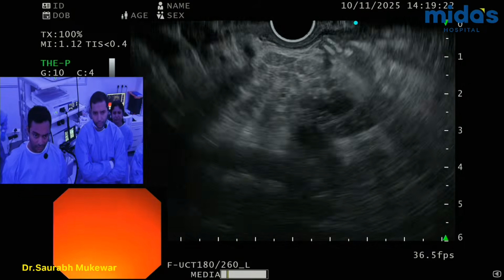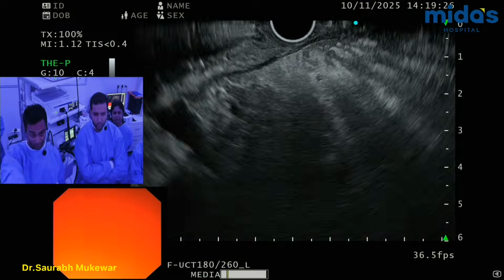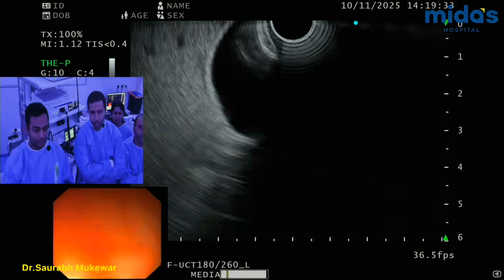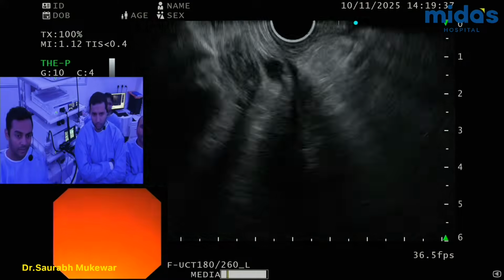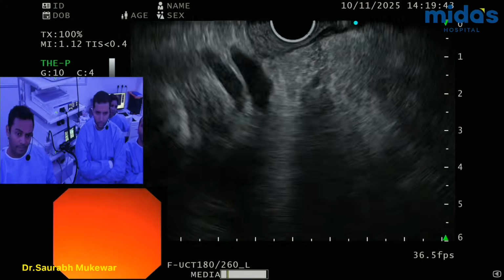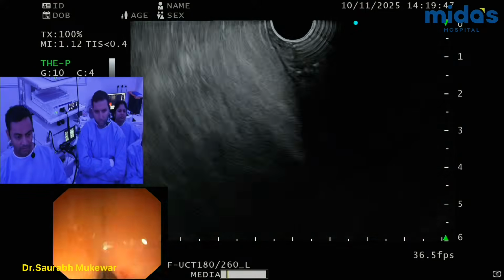Now, here's a challenge. Now, I can't really go here because it's the head and the lesion is at 4 or 5 o'clock. Before, when we started, you see, it was a very nice position where we actually were getting the thing on the left of the screen. Let's see if I can manage to do that again with this lesion. Okay. All right, let's go to D2. Let's see if we can find an access from there.